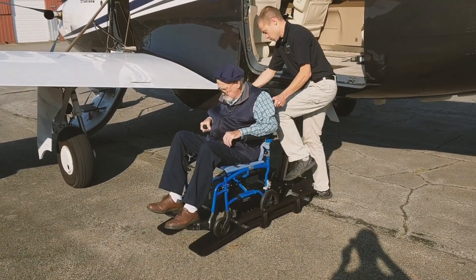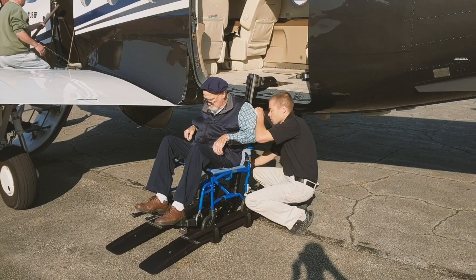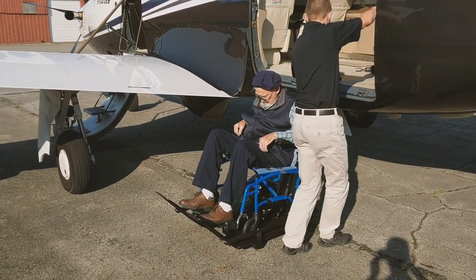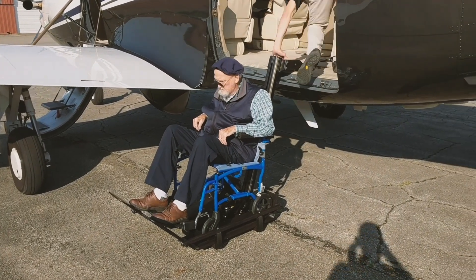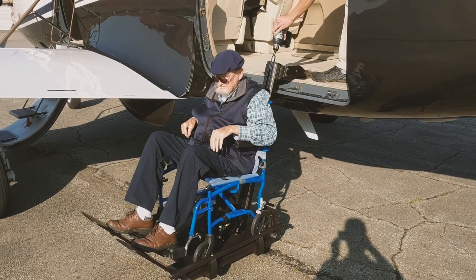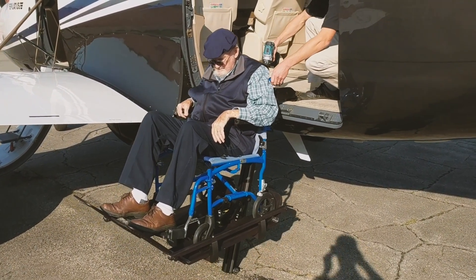The Pilatus PC-12 is an excellent family transportation airplane, but what if one of the family members is wheelchair-bound and unable to climb the entry stairs? A New York-based company owns two PC-12s and was faced with this problem for one of its frequent travelers. Instead of adapting a wheelchair to somehow fit on the PC-12 stairs, the company's pilot and industrial designer Gideon Clement came up with a simpler idea.